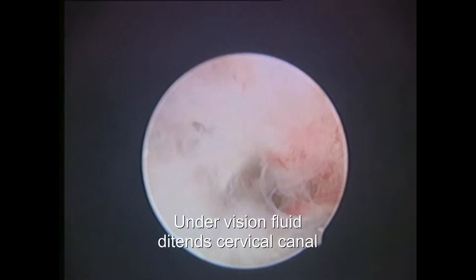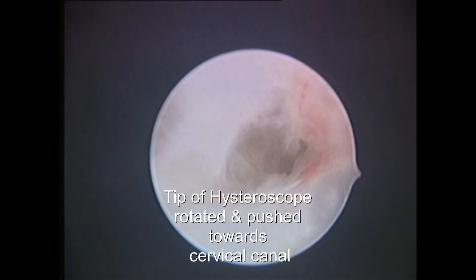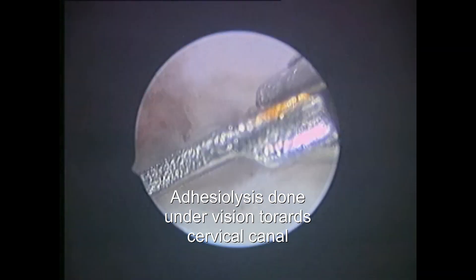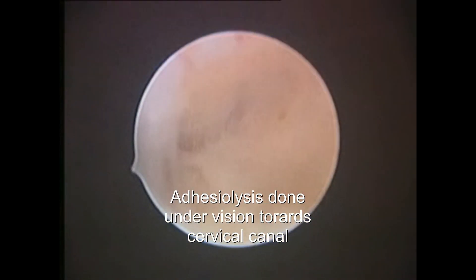We are using a 2.9mm hysteroscope and trying to negotiate to put it in the cervical canal, but you can see it goes in a little and then you can't see anything. The fluid is trying to distend the cervix, but at the isthmus it's not negotiating. To avoid producing a false passage, we started by placing scissors in the operating sheath and doing a little adhesiolysis near the isthmus.